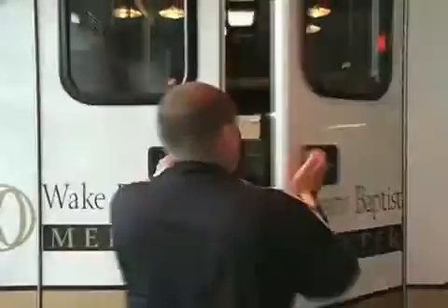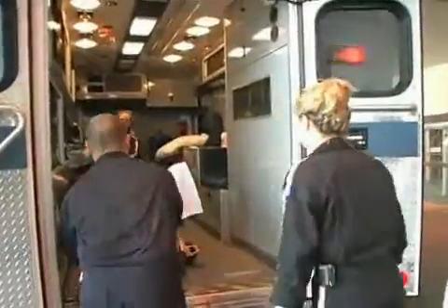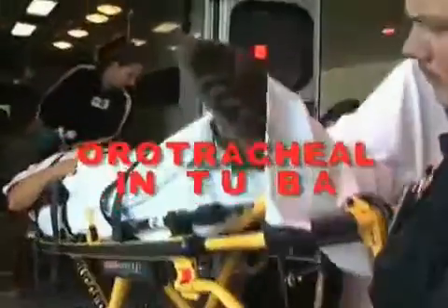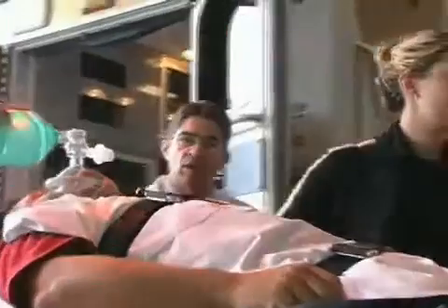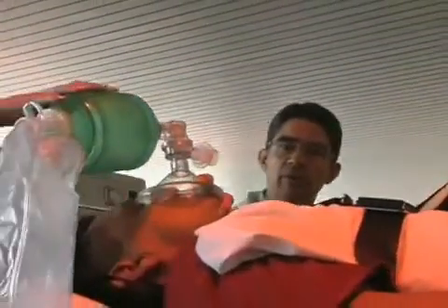Control of the airway is the single most important task for emergency resuscitation. I'm Dr. David Klein, an emergency physician and an editor for Tintinalli's Emergency Medicine. Oral tracheal intubation is a routine procedure for the emergency physician, yet no other procedure will save more lives.